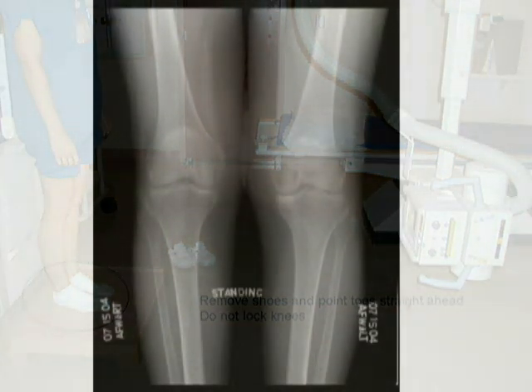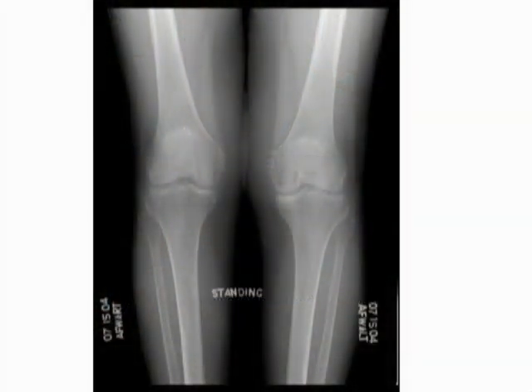An AP standing knee radiograph should demonstrate all skeletal anatomy from the distal femoral condyles to the proximal tibia and fibula. The patella should be completely superimposed on the femur. An appropriate contrast and density will demonstrate both soft tissue and trabecular bone.